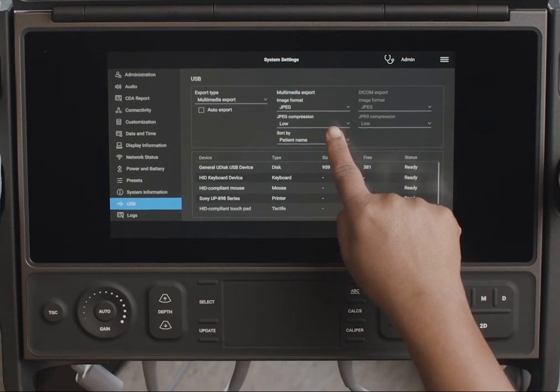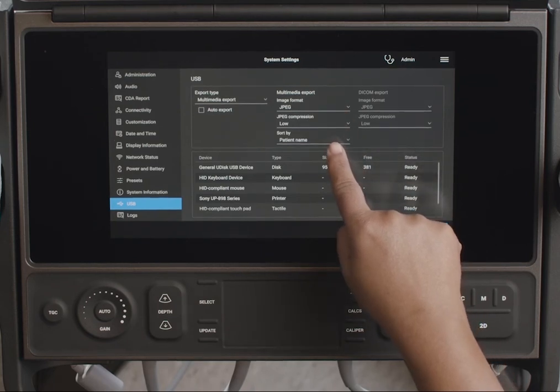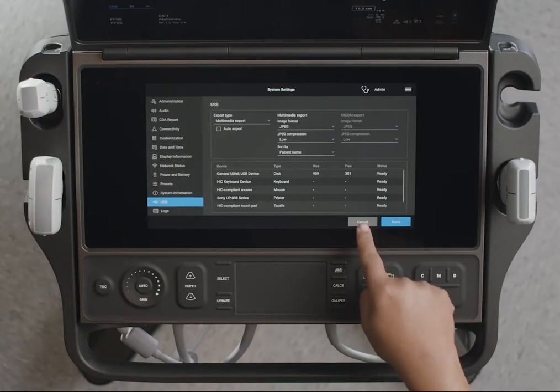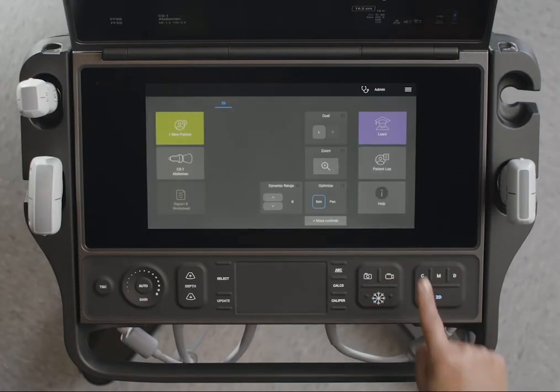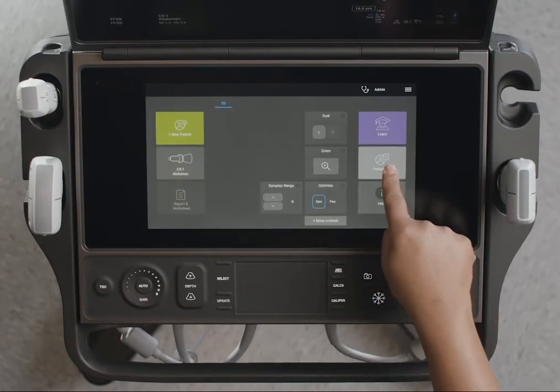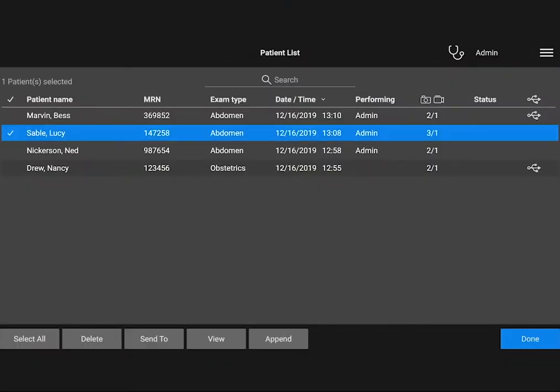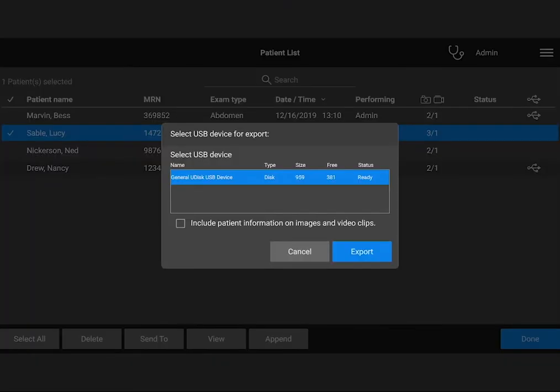There are a few other export options you can choose. Now that we have our export options selected, let's export some data. You'll need to select a study from the patient list and then choose to send the study data to your USB device.